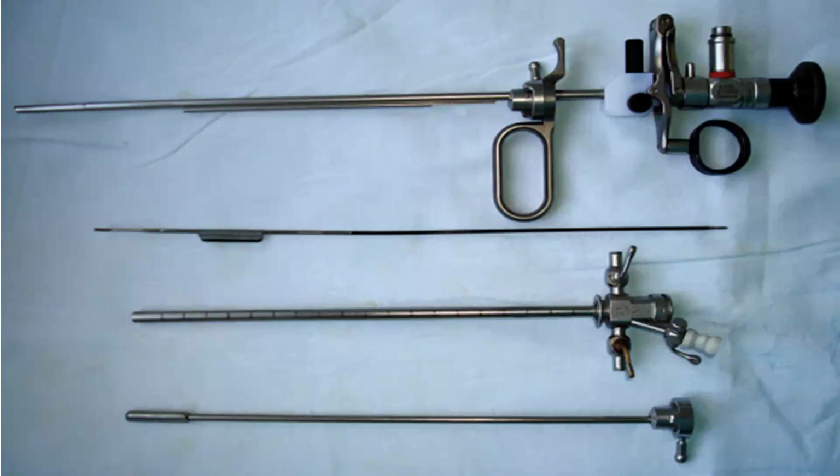Start from below. Yes, sir. The below picture shows the obturator, followed by the VIU sheath of 21 French with markings on it, with a beak which is oval straight, and a channel on the top of it, and a working element, and the VIU blades.